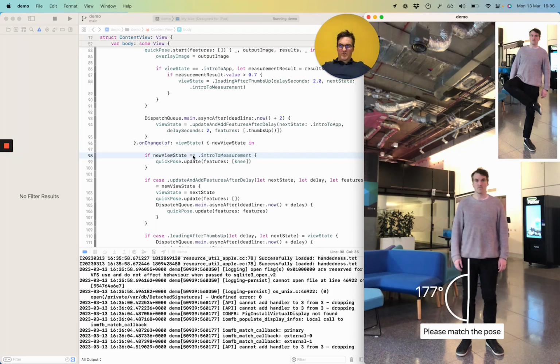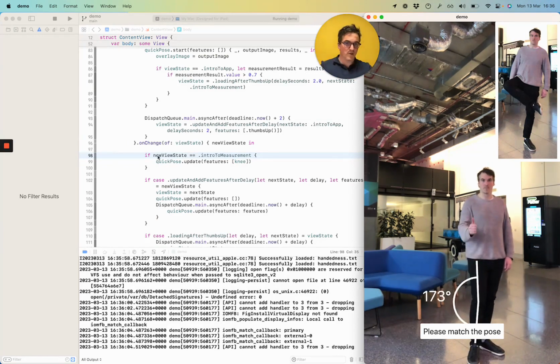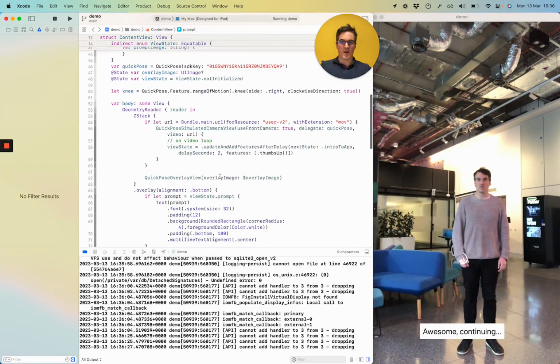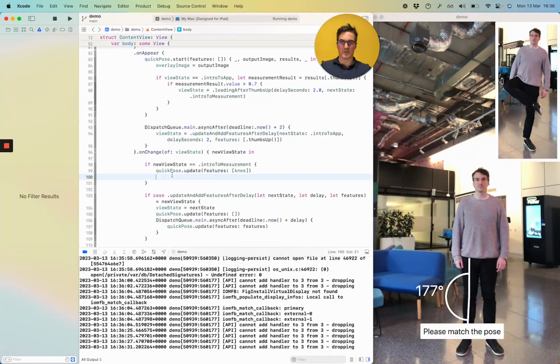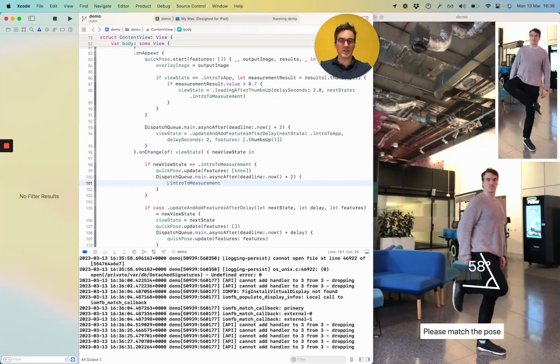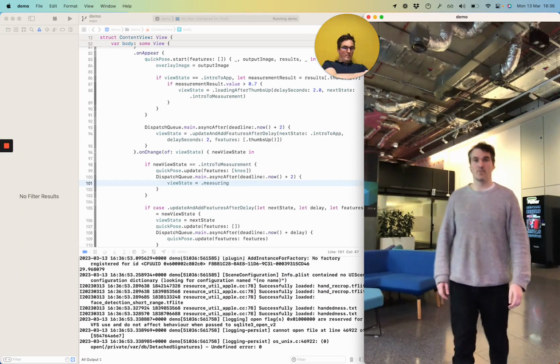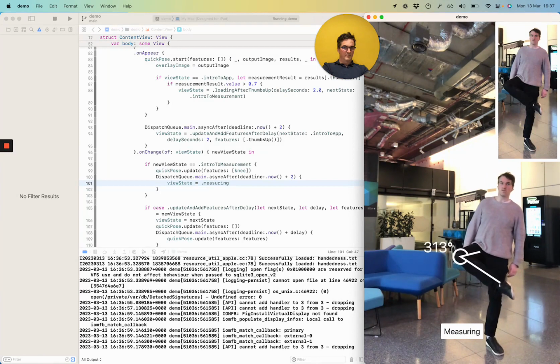Okay, well, we can start moving on to more advanced features now. I note that we're not actually capturing the measuring result. So it says, please match the pose, but it doesn't actually give the user the next prompt. So we're not getting measuring. So how about after the view state is changed to intro to measurement, we wait a generic 2 seconds and then change the prompt to measuring. And we could do this with a thumbs up again, but we want to use those quite sparingly. Measuring, very good.